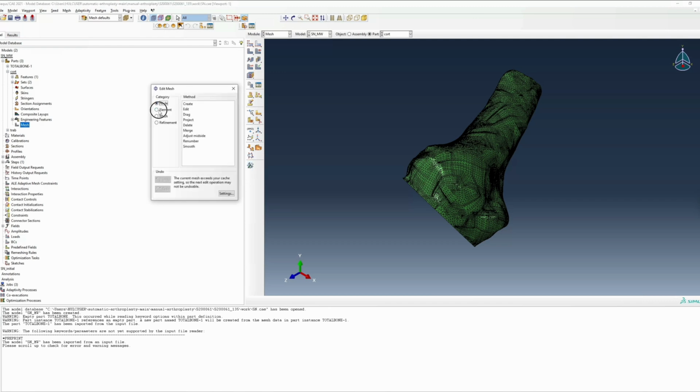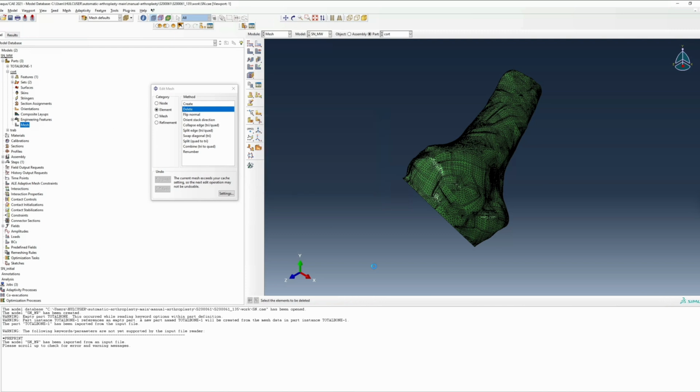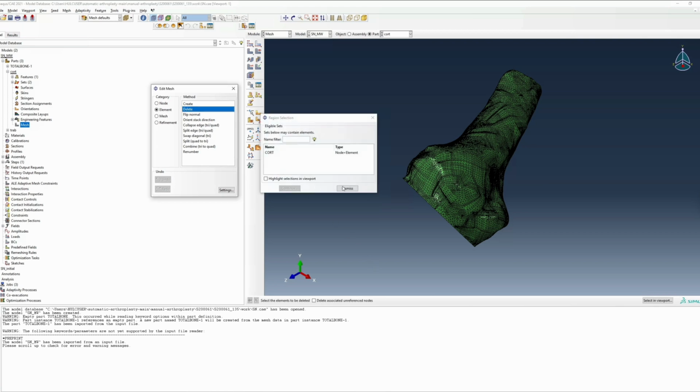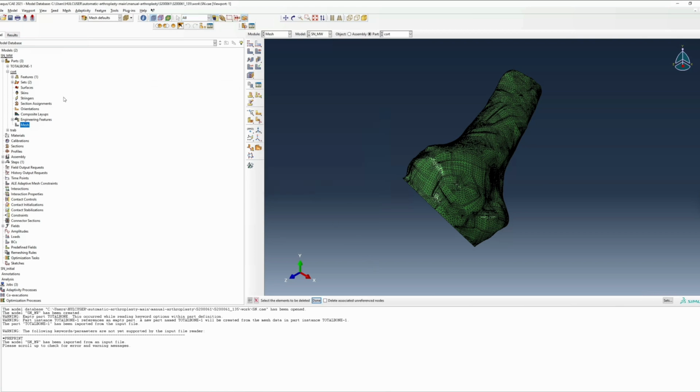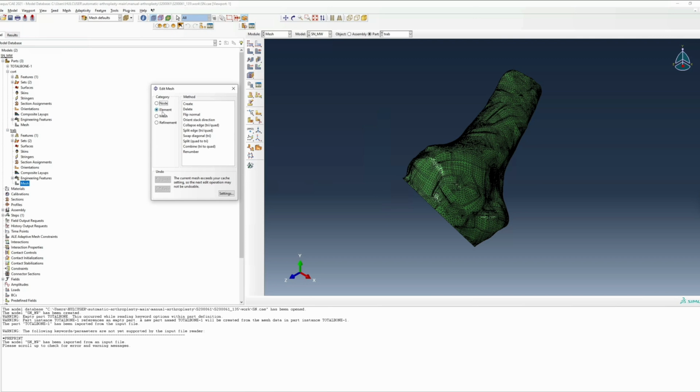Now this is why it's very important that you create the sets in the first step, because as we work here, we're going to use those sets to delete the associated elements and discretize back into our trabecular and cortical meshes separately. This can be done by deleting all of the associated trabecular elements from your cortical model and vice versa.